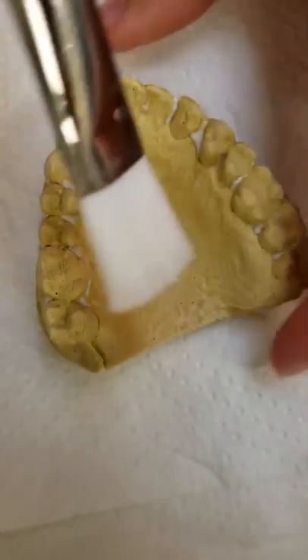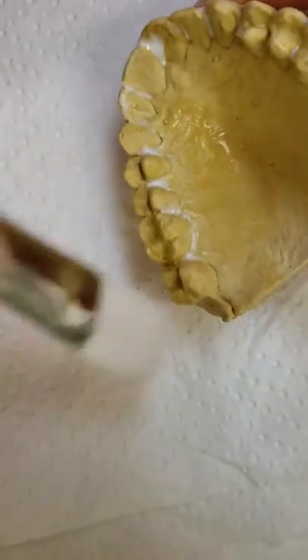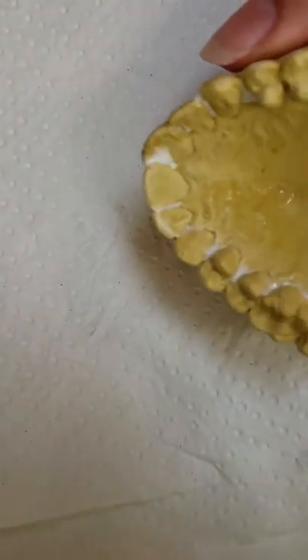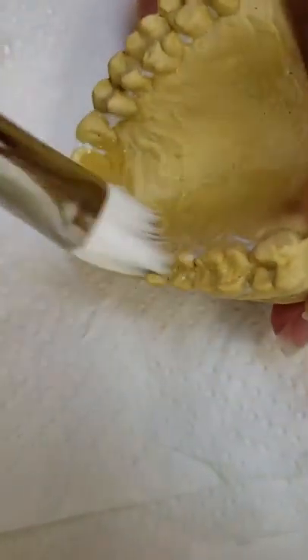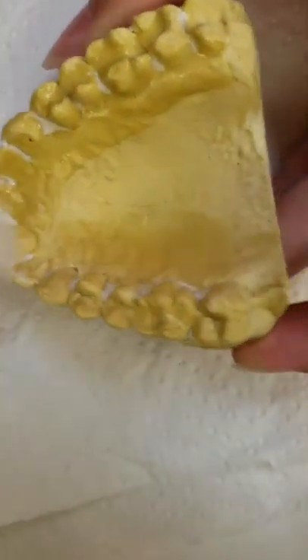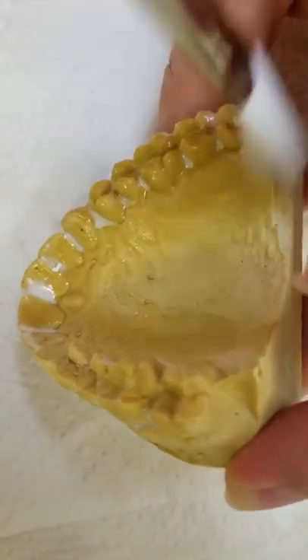Sometimes I'll just dump it right on. Really, you don't have to paint the whole model — I just like to paint a good amount of the soft tissue area around the teeth because it makes it easier for the tray to separate. You want to do it all the way around, buccal and lingual.